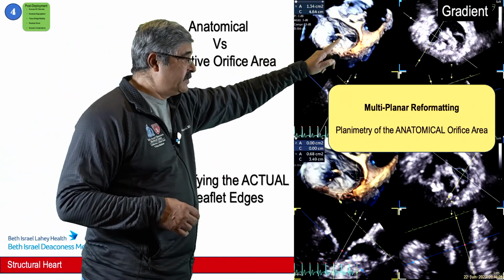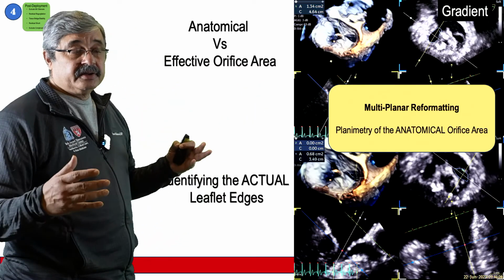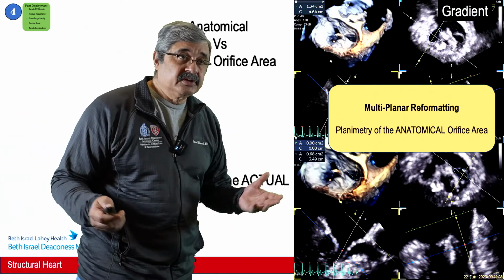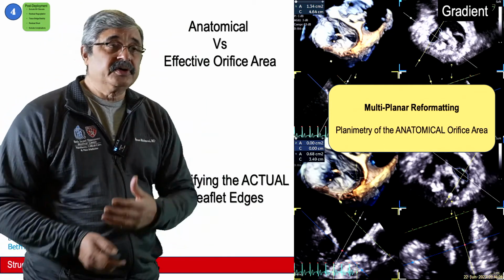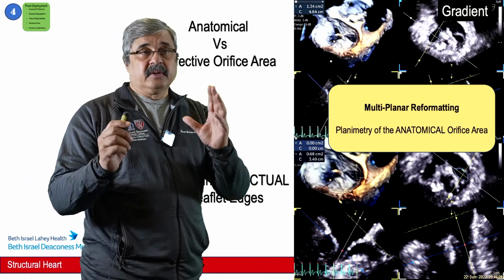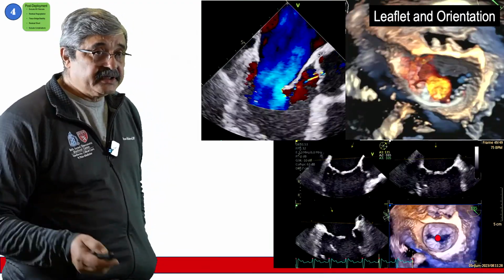So in this specific patient, the one that you saw which had a mean gradient of about 5, when we planimetered both the areas, the total area of the mitral valve turned out to be more than 2 square centimeters. So that was good. In that case, we identified that this is possibly related to flow, enhanced cardiac output, tachycardia. So we could ignore this, because the actual anatomical orifice area of the mitral valve is pretty significant.